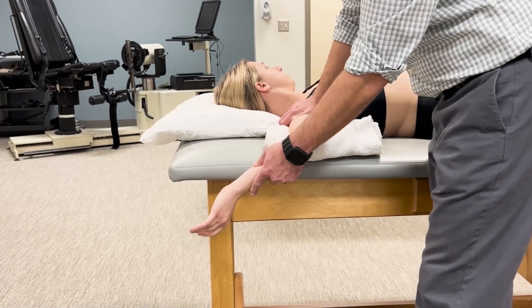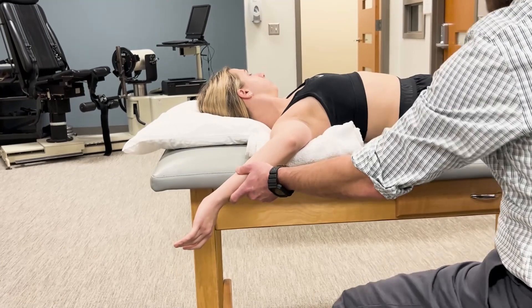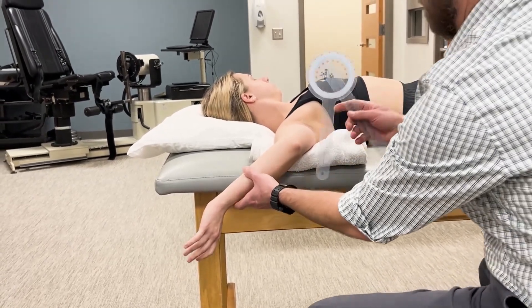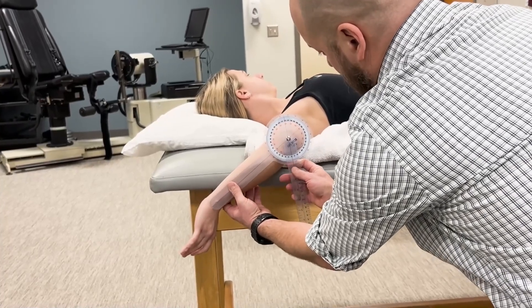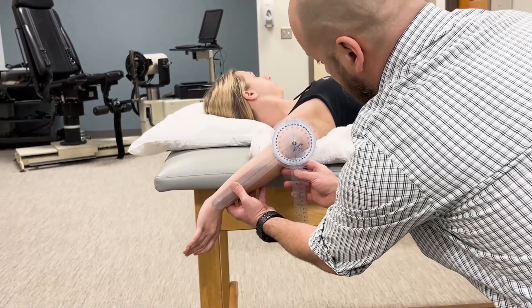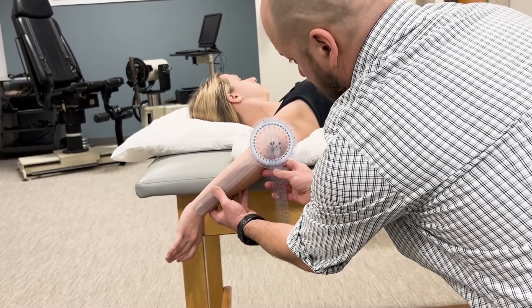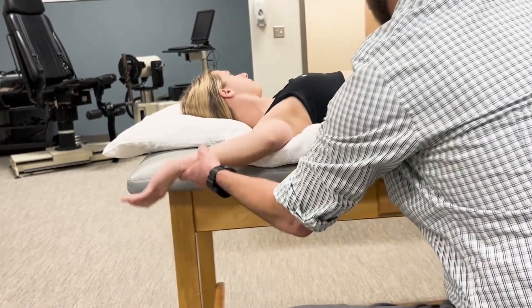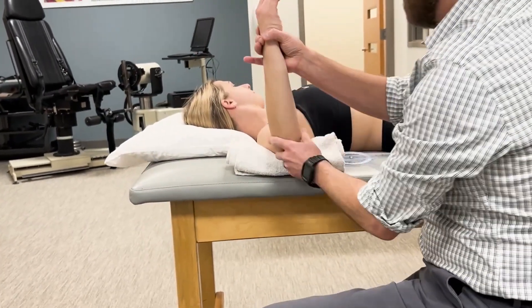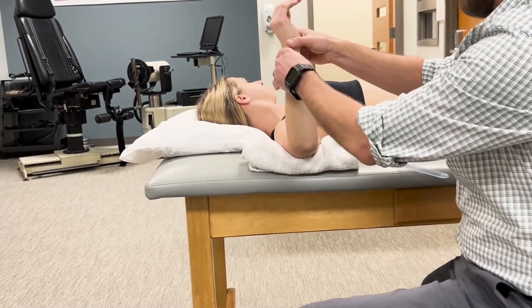I can spring against the barrier and estimate about 105 degrees. While maintaining that position, I take my measurement. The reference is parallel with the line of gravity and the indicator is parallel with the forearm. I also want to mention the zero position for this measurement: zero position is the forearm vertical, or parallel with the line of gravity.